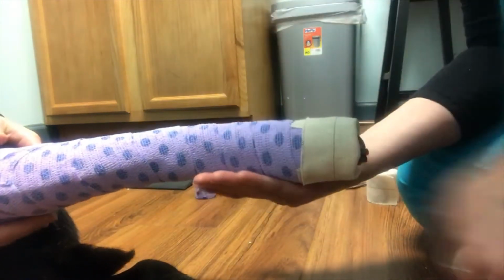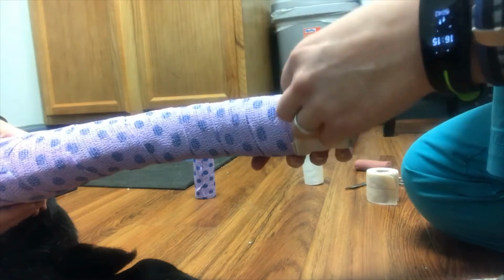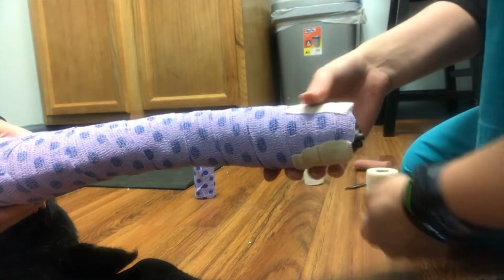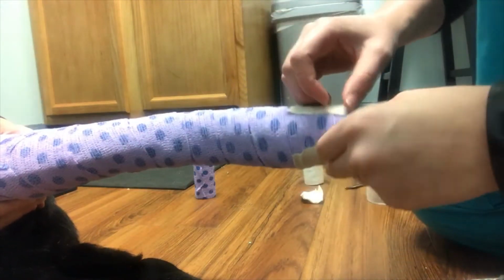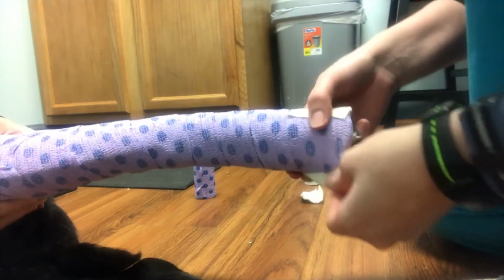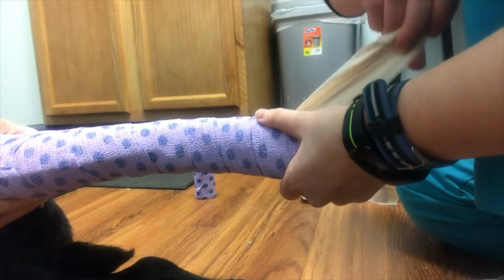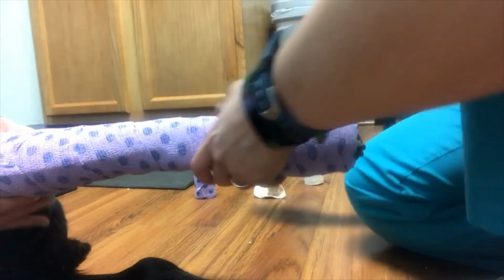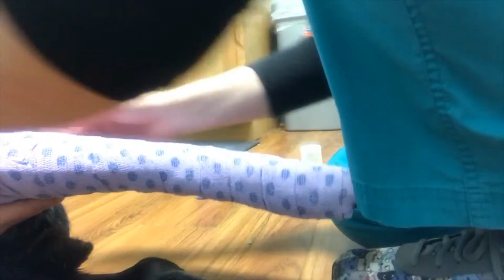To remove it, the first part you want to do is take off the Elastikon. Pretty much going to go exactly in reverse. Oops, if I can get it off because it likes to stick. It does its job well. Some people will use a dual blade and cut down the splint, or you can just use bandage scissors, or I even just prefer to take the vet wrap and just unravel.